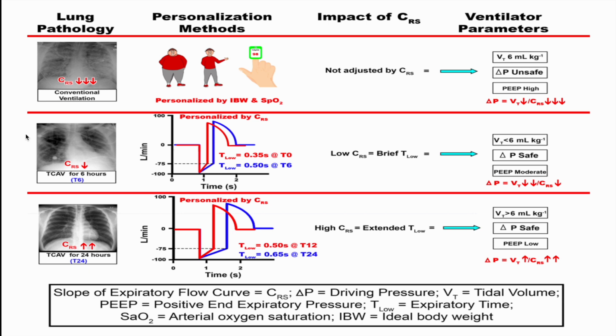However, in this particular approach, that is the time approach, what you see is, as the compliance is low, we start with very low expiratory times, and gradually we increase it, even increasing the tidal volumes as our lungs slowly start to improve. So this is the basic approach.